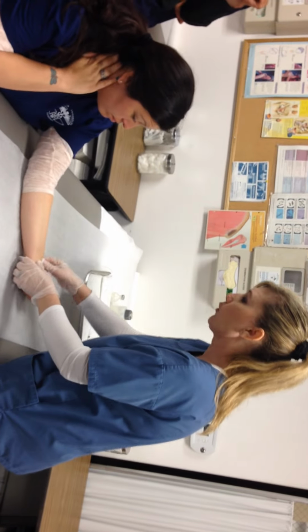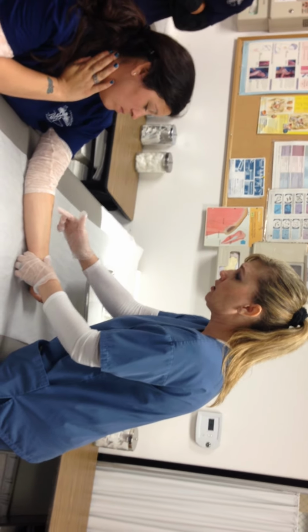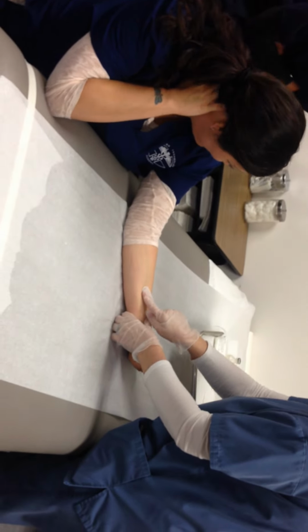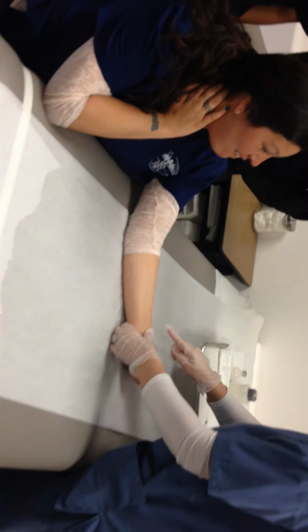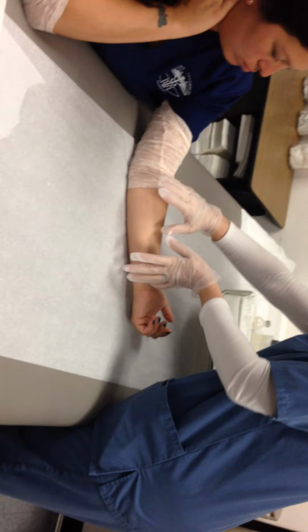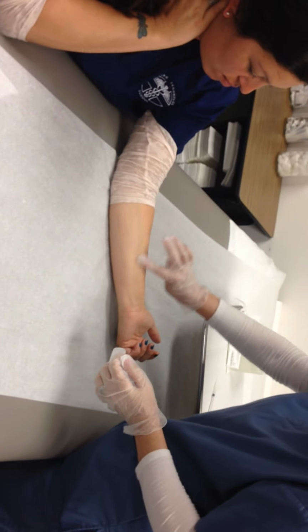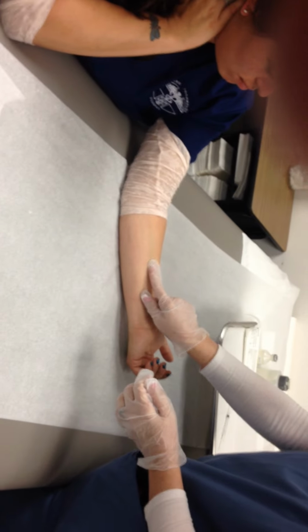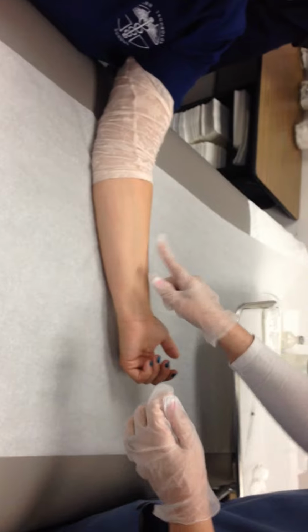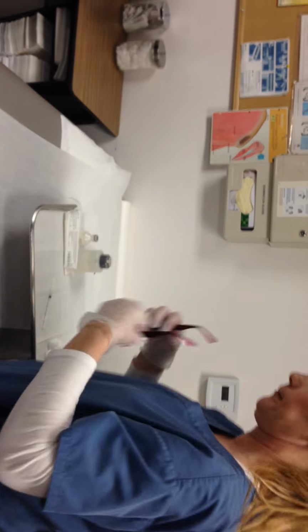So what are we looking for? We're looking for that we're not going to go in any veins. And look at her. She's just obvious. There it is. Boom. Okay? We're not going to go into there. A big one, huh? Yeah, it's a big one. So how do we measure? We're going to go from here to here, and we're going to go right in the middle. So I just kind of do that, and then I look. So this is the area in the middle, but there's her vein. So we need to go to the side of it. Okay? We don't want to go in it. We need to go just under the first layer. Okay? Now I need to be able to see what I'm doing.